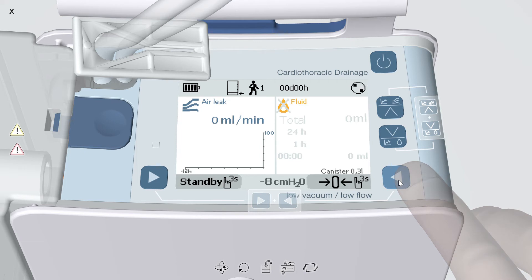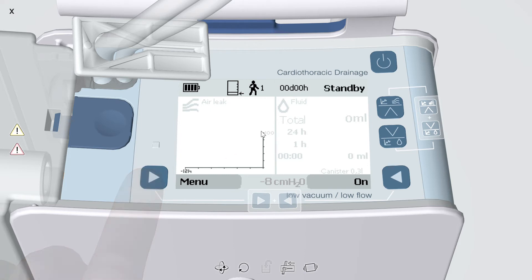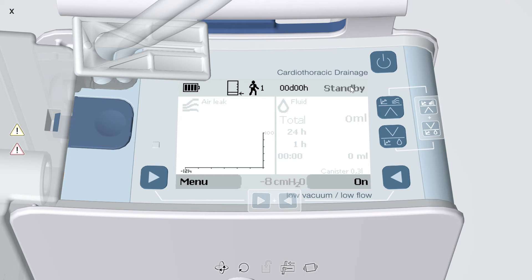To put the device in standby, press and hold the bottom left arrow for three seconds. You should then see standby in the upper right corner of the display. Switch Topaz Plus to standby to take a drainage sample with a 17-gauge needle or smaller, to power off the device by pressing the power button, to change the Topaz Plus tubing, and also to change the canister.